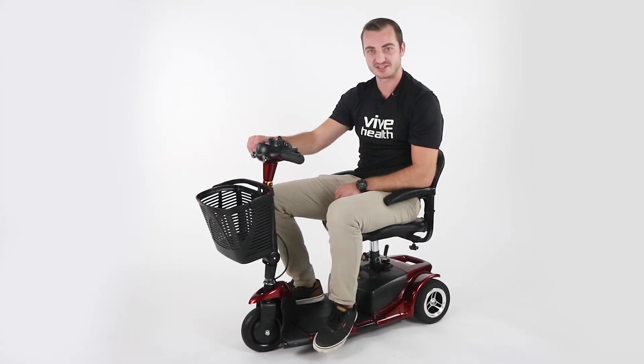The first thing I want to point out is that the scooter breaks down into four pieces, making it ideal for travel, with the heaviest piece weighing only 29 pounds.